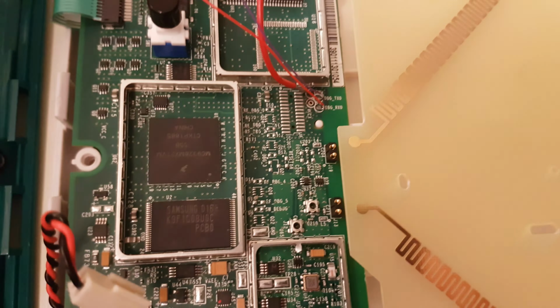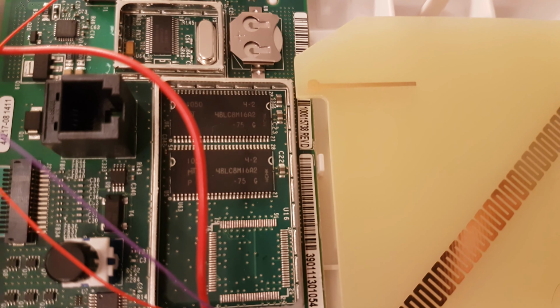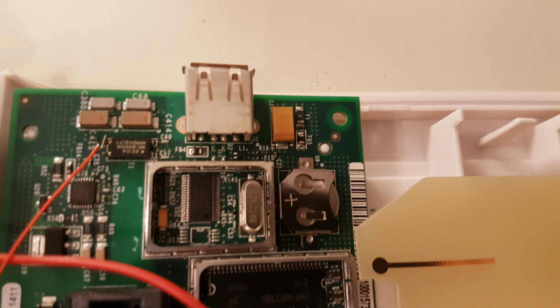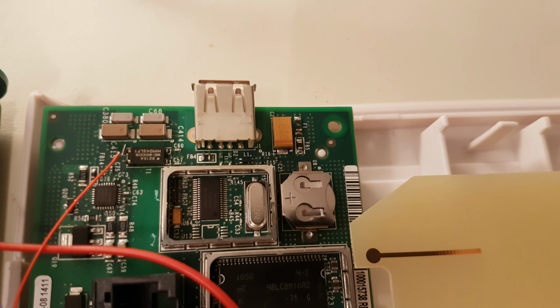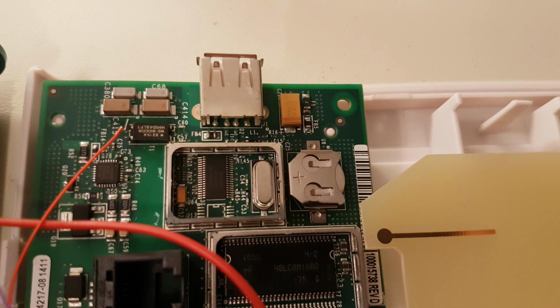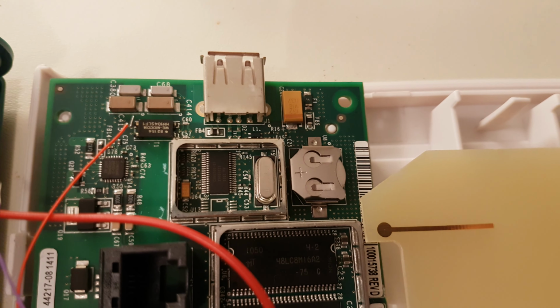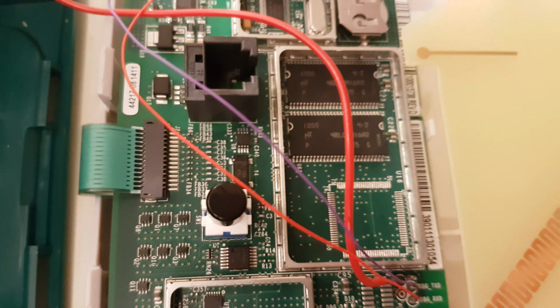Up here we have a microcontroller. That's the square one, and some flash. And I believe that's a 128 meg flash chip. I could be wrong about that. And it looks like there's some SDRAM here. And then up here, it looks like we've got some silicon for dealing with USB, a battery, and just to the left of that battery is a crystal, probably a clock for USB. I'll have to look into that to confirm.